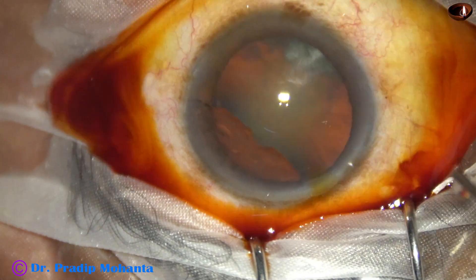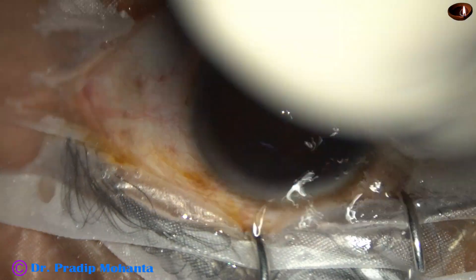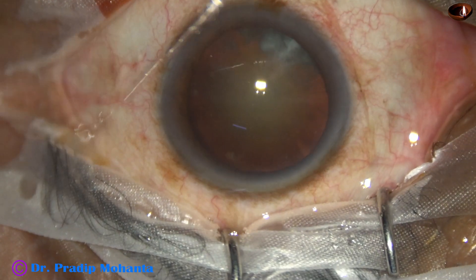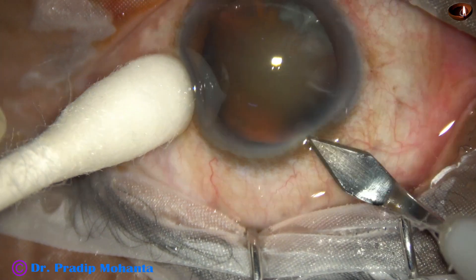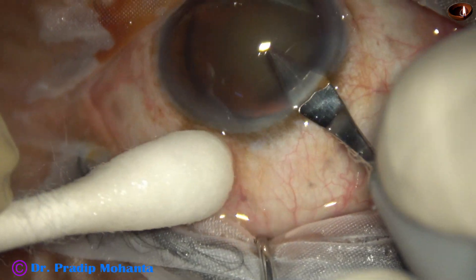Friends, let us observe this totally unedited real-time surgery. The ocular surface is thoroughly irrigated with BSS, applying few drops of povidone iodine. The ocular surface has been prepared with povidone iodine — in the preparation room we applied few drops and kept it for three minutes. This is just a running wash.